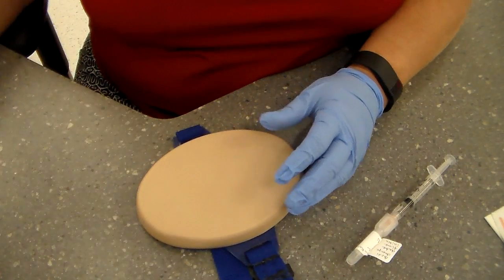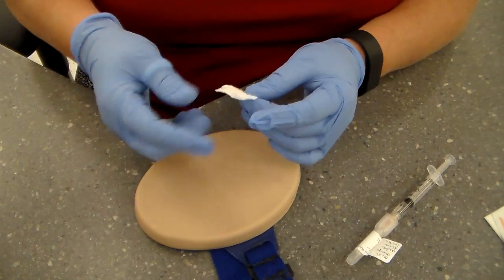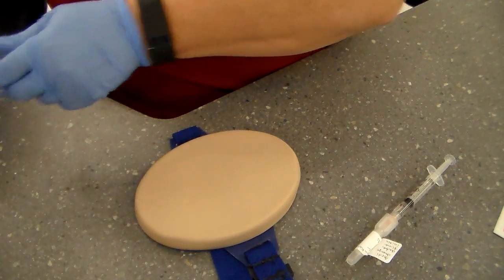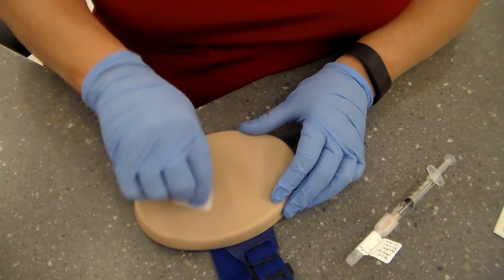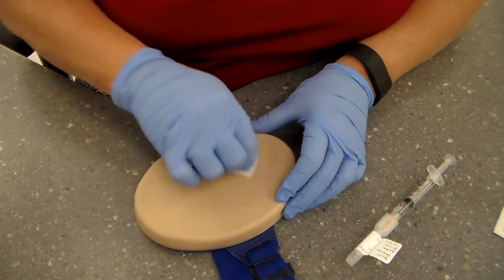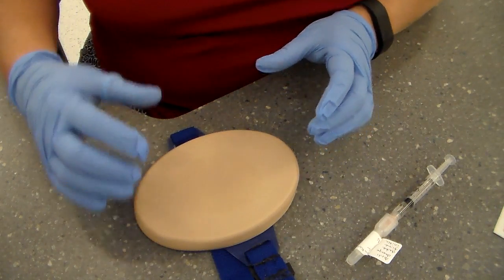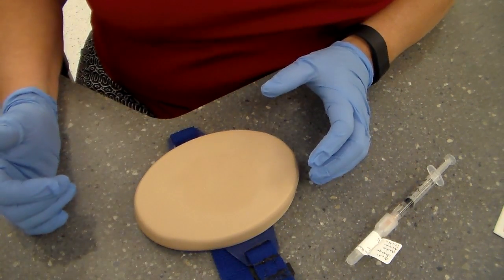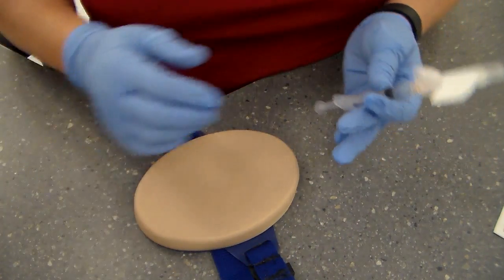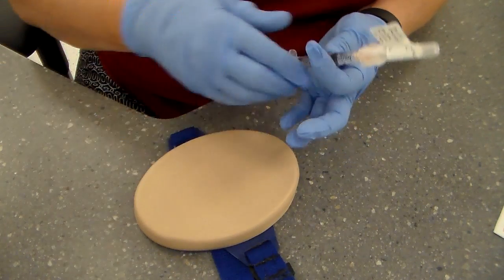All right, so what you're going to do is clean the site with alcohol, with a rubbing, whoops, that dried right out. Let me get another one. You're going to go in circles and clean the area. You're going to start from the inner and move out. And so that's going to be our area to administer our medication. You're going to let the area air dry, because that kills the greatest amount of microbes.